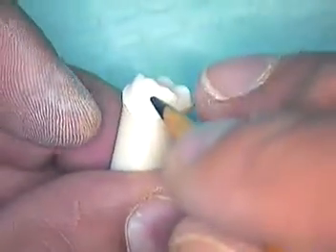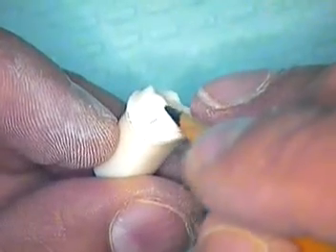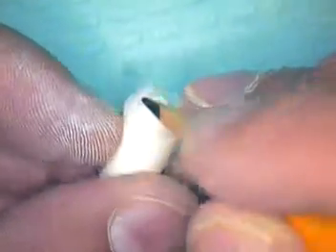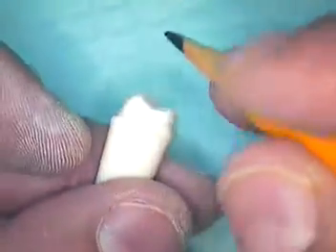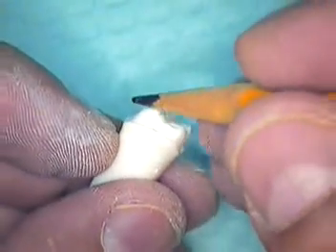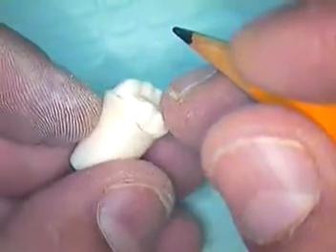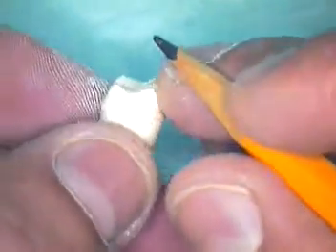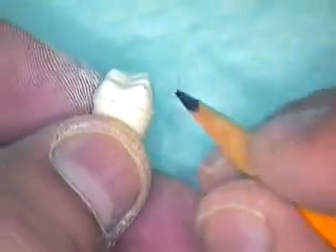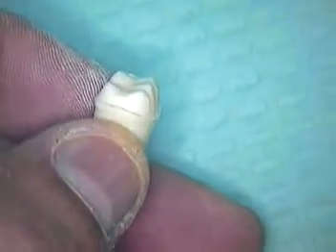The preparation itself at the middle portion starts to taper in, and then toward the occlusal it starts to roll in — that's important because the amount of reduction has to increase toward the chewing surface for strength of your restoration. The lingual is the same: it rolls in with a nice smooth roll, not a sharp roll, but more of an S-contour as we discussed earlier.